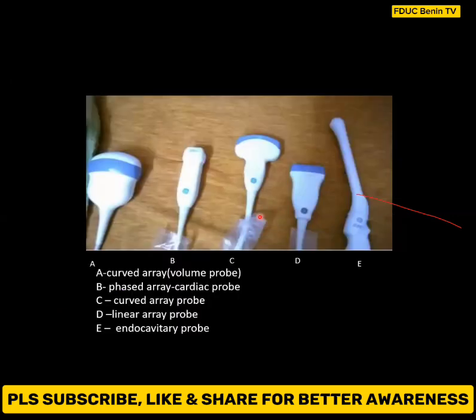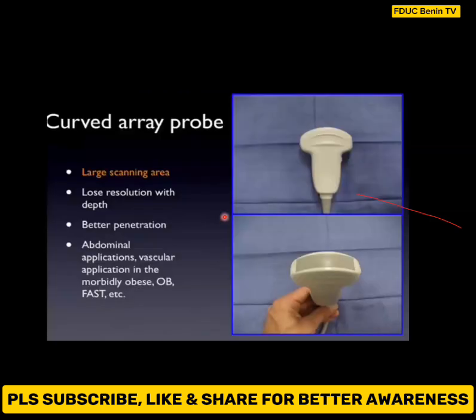I'm going to talk about the different types of probes. If you're doing ultrasound of the pelvis or obstetric ultrasound, the most important probe we need is the curved array, or curvilinear probe. This one uses low frequency and has a large scanning area. Because it's low frequency, it has better penetration, but it loses resolution with depth.